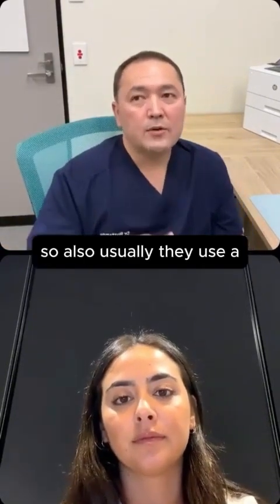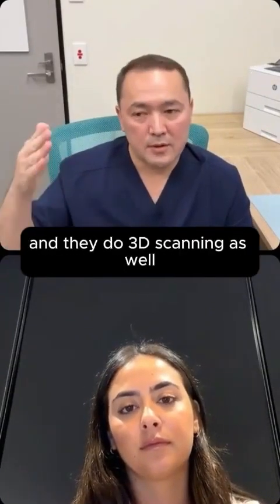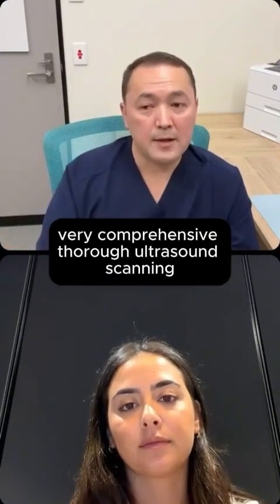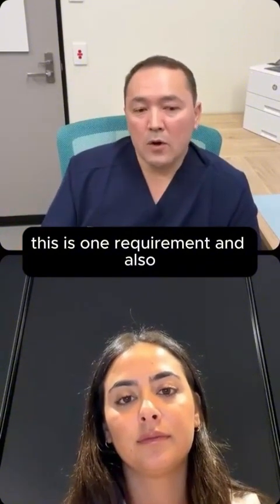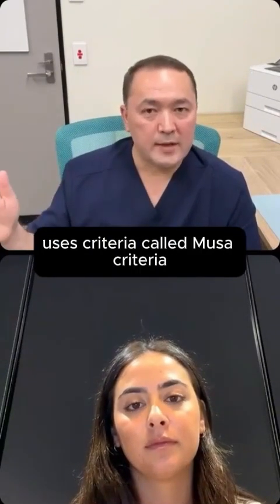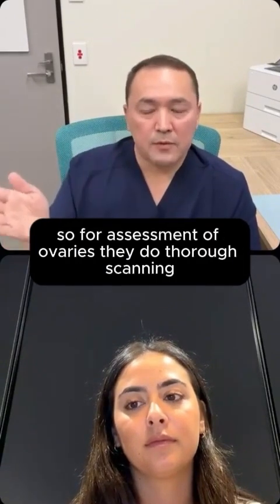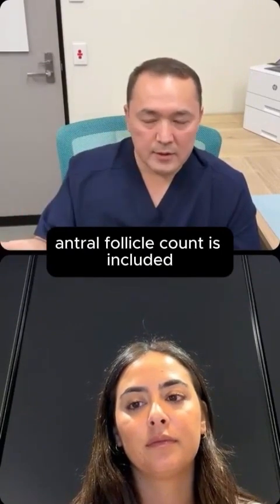Also, generally they use much more powerful machines, and they do 3D scanning as well. So that's very comprehensive, thorough ultrasound scanning. This is one requirement. And also deep pelvic ultrasound scanning uses criteria called MUSA criteria for assessment of the uterus. For assessment of ovaries, they do thorough scanning, and antral follicle count is included.